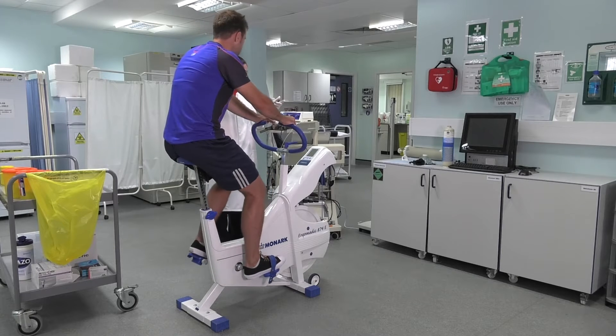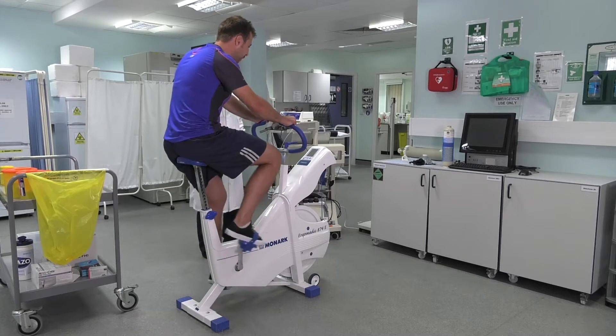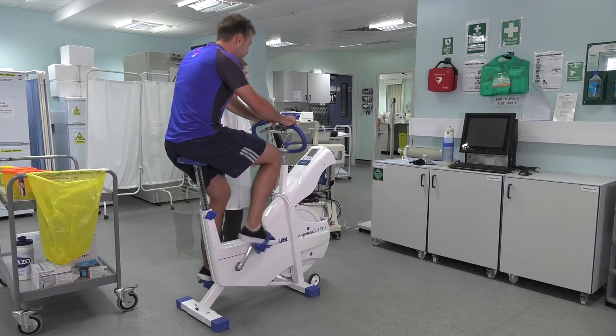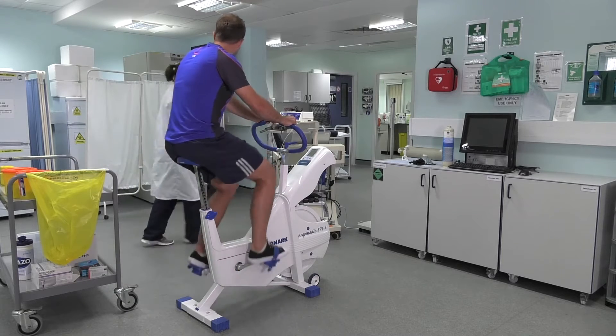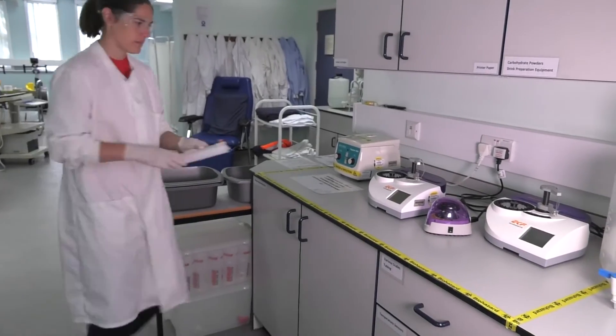Get your participant to do a 10-minute warm-up — start the clock to get them warming up. You can then go away and analyse your resting sample whilst they're doing a gentle warm-up.